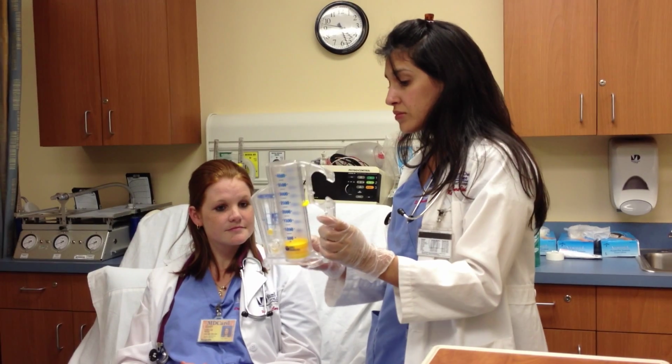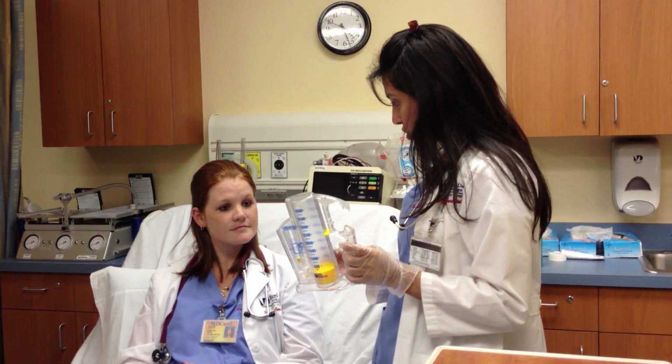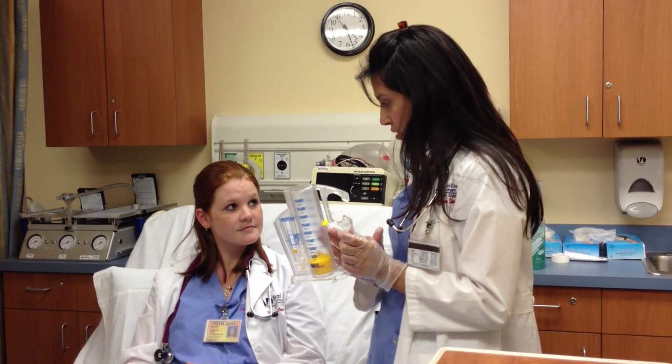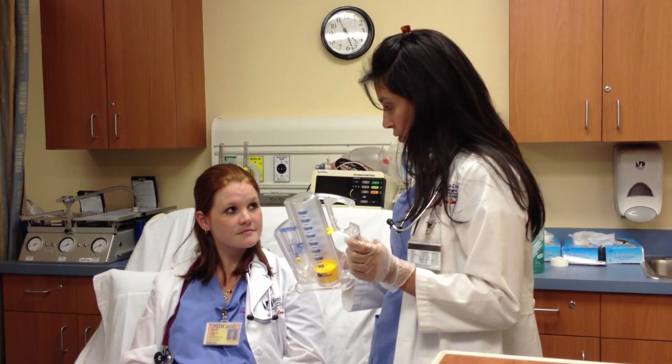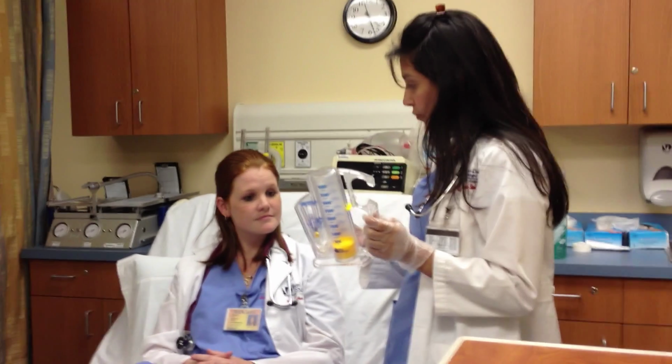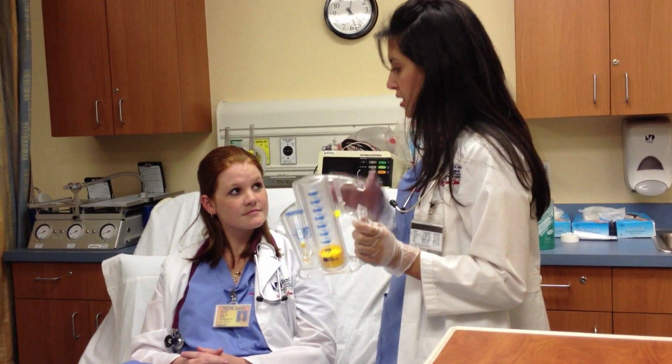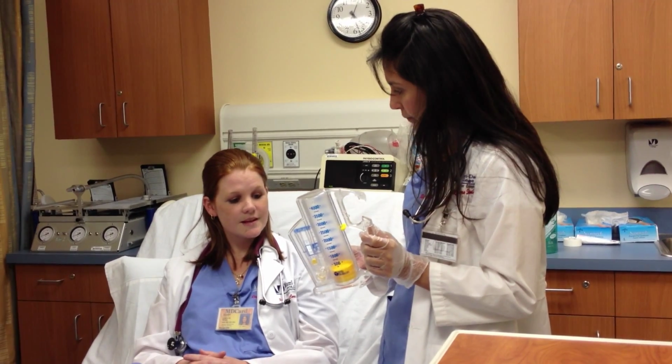Now, Krista, after you finish with your surgery, I need you to use this device. This is the way you will use this device. You would exhale normally. You would take a deep breath, hold your breath for 5 to 10 seconds, then exhale normally. Do you think you could do that for me now? Yes. Thank you.